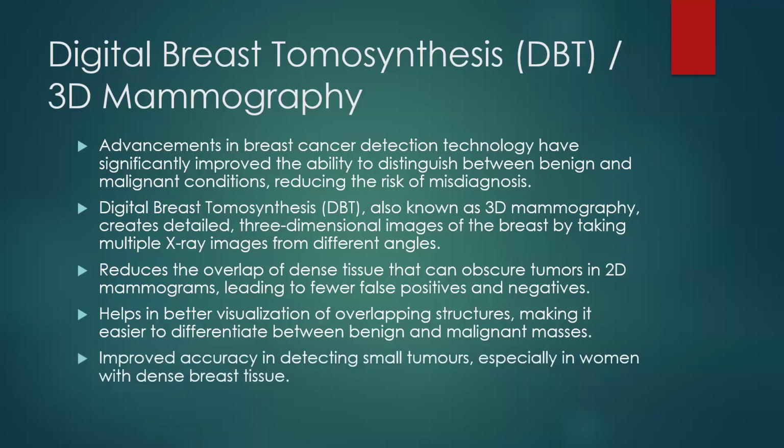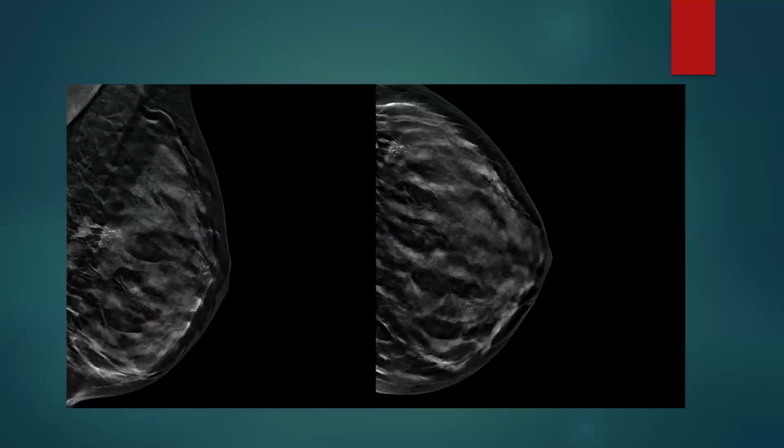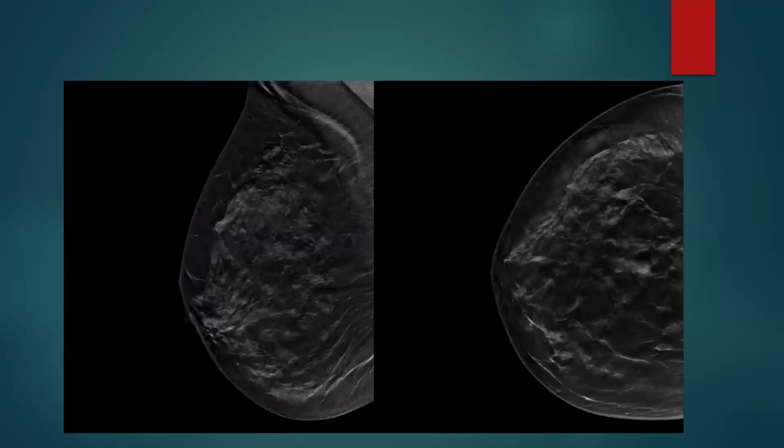Improved accuracy in detecting small tumors, especially in women with dense breast tissue. And this is an image of 3D mammography that shows an excellent view of very small, tiny calcifications seen with very high resolution.